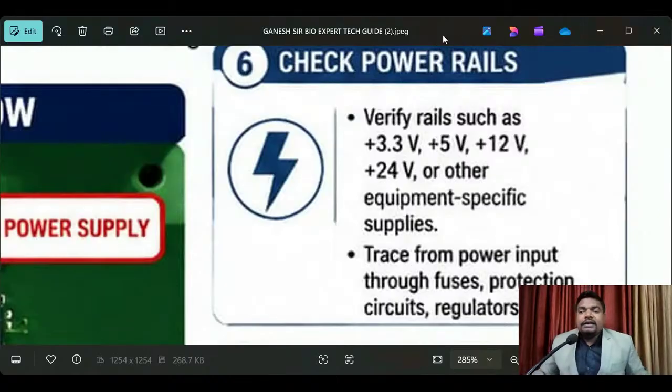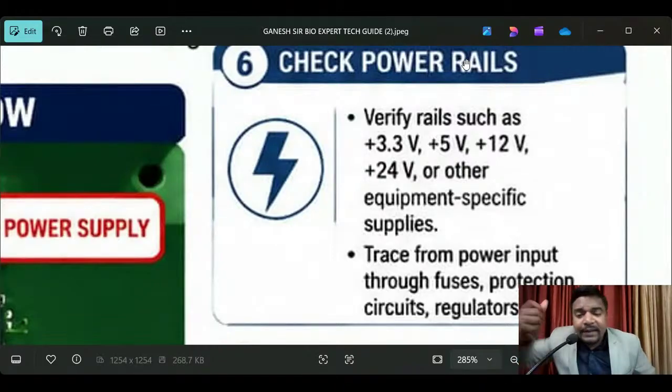When I'm saying these things, you listen, but after listening, if you are really interested and want to become a technical biomedical engineer, then whenever you are free, go to the hospital, open and remove one medical equipment and check everything: what boards are there and how the tracks are going. Everything you have to monitor practically. Here I am giving instructions. Whoever has no idea, whoever is suffering, and whoever feels panic and fear, I want to give full clarification through my live sessions.